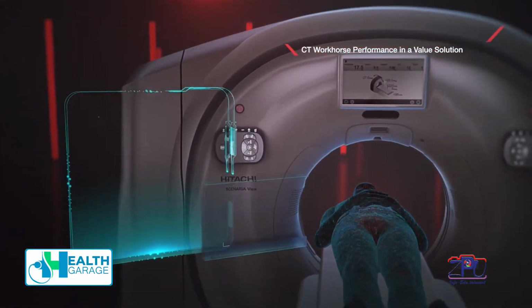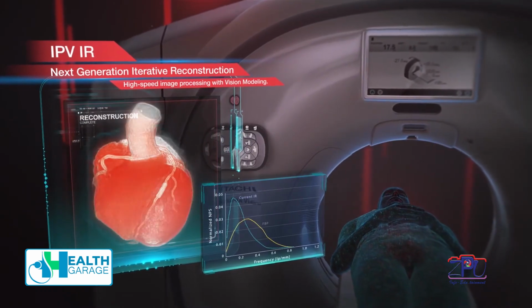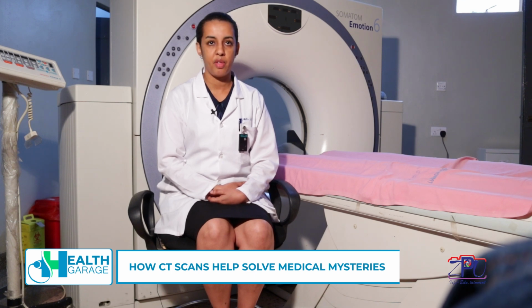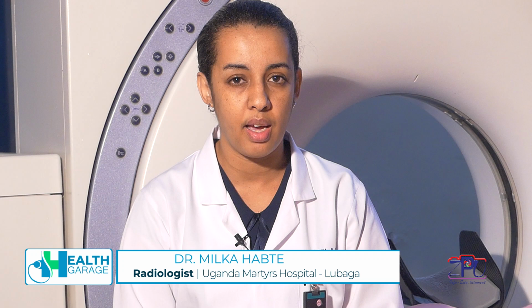Just like any other technology, we have evolving technologies in CT scanners. We are able to do so many investigations which were not very clear in the past. We're able to do different investigations of the vessels in all parts of the body, and because of the evolving technologies, the images are much clearer, and the radiologist is also able to reach an accurate diagnosis because of the clarity and the resolution of the images produced by the scanners.